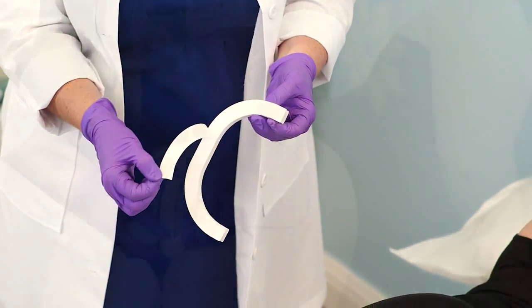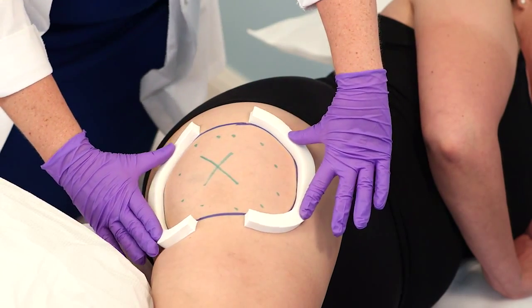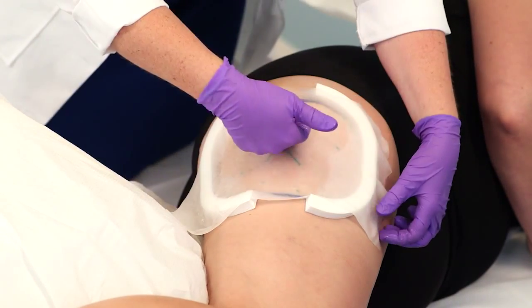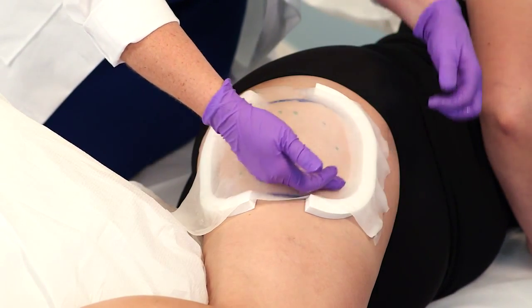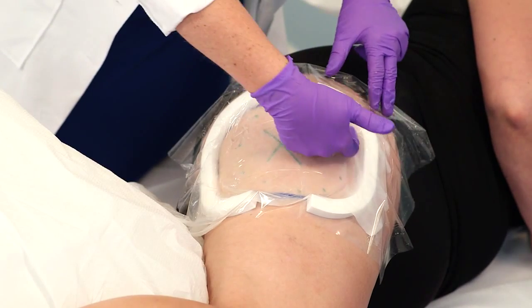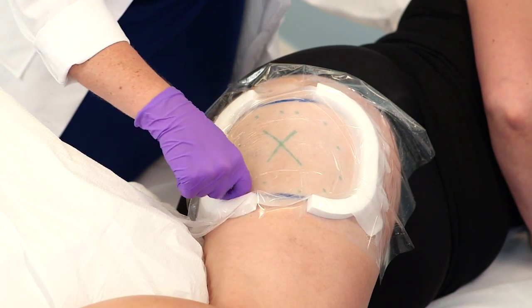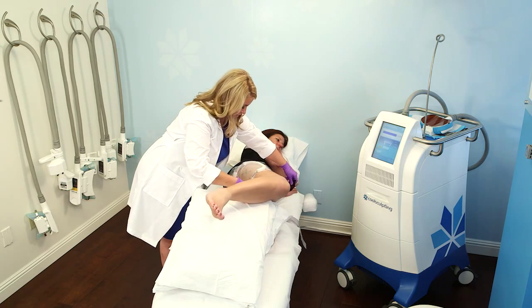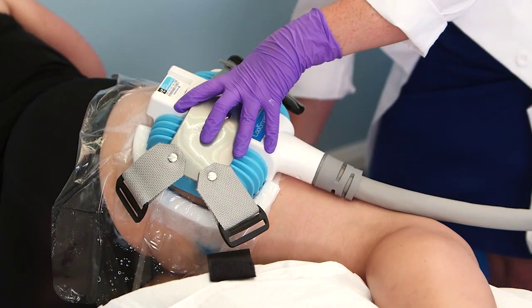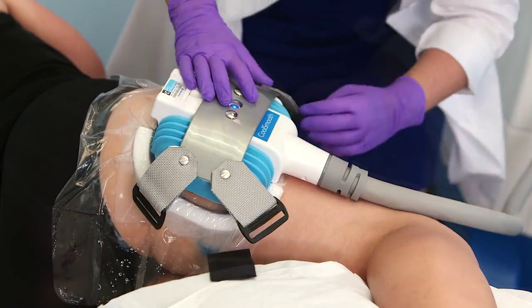Remove the adhesive foam borders and place them around the shorter sides of the template outline so that the markings are still visible. Gently place the gel pad over the treatment area, extending past the foam borders, and use the back of your fingers to smooth and remove air pockets. For a more comfortable experience, consider using absorbent pads or towels as a barrier between the Velcro straps and the patient's skin. Place the black strap between the legs felt side down. Position the applicator inside of the foam borders with the umbilical going down the leg. Use one hand to firmly hold the applicator at the treatment site and secure the Velcro straps loosely into the securement anchor.